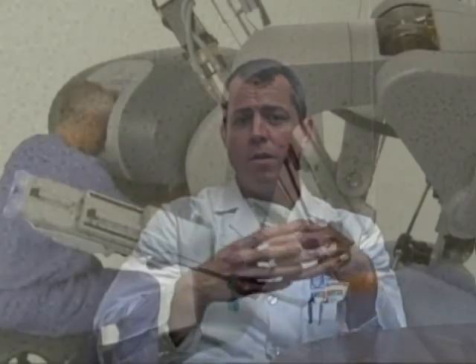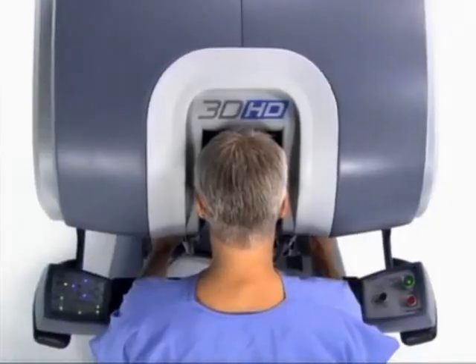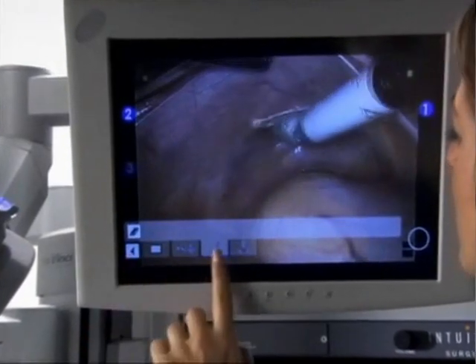We've been doing the Da Vinci for a couple of years now, and what we have found is that there's numerous mechanical advantages to the Da Vinci robot over a straight laparoscopic prostatectomy and certainly over an open prostatectomy. First of all, there's dual high-definition optics in the camera lens, which gives you a stereoscopic depth of field, and it's also under 10x magnification, so that gives you tremendous detail. It's virtually a bloodless field because the insufflated abdomen compresses any venous bleeding, so there's virtually no bleeding.